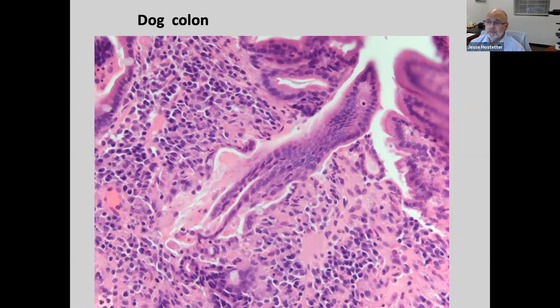This is a dog, could be the same as the one we saw last time. This is an extreme close-up of the colon. Anybody see an etiologic agent here? While you're looking, I'll answer one question about how you would definitively confirm the presence or absence of lymphoma in that crypto case. I probably would send it in for PARR, because if I do CD3, it's going to light up strongly in the epithelium. I think you'd have to use PARR or treat for crypto and see if it gets better.